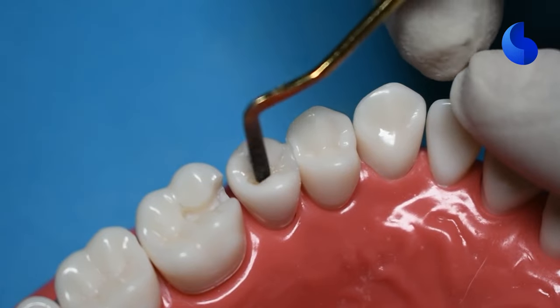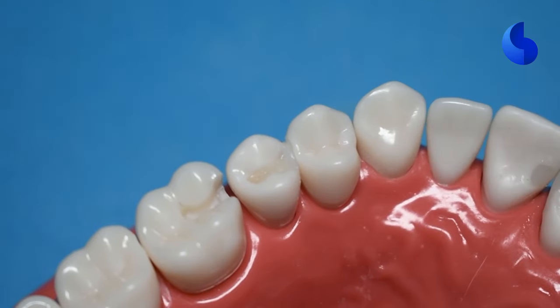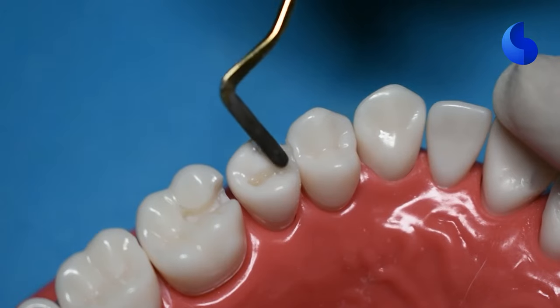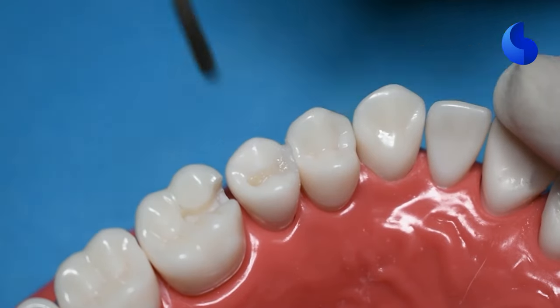And as you add the composite material, try to place it anatomically like we're doing over here, condensing it to the walls of the preparation instead of just adding it in bulk. That way, you can save yourself some carving and it gives you a more anatomic fill.